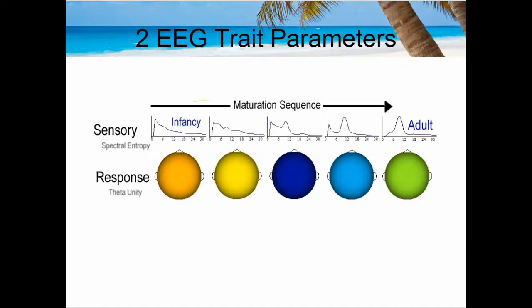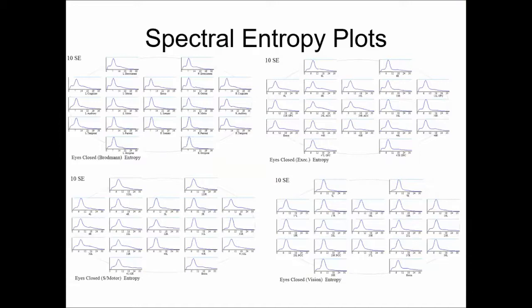And when you have orange or yellow, you have instinct, the subcortex controlling the person, and the neocortex is not really in charge. And then the neocortex can be too intrusive in a way. You want to get a balance point. That's what the green is. Okay, so this is the individual, and we're looking at 19 regions over here on the left.